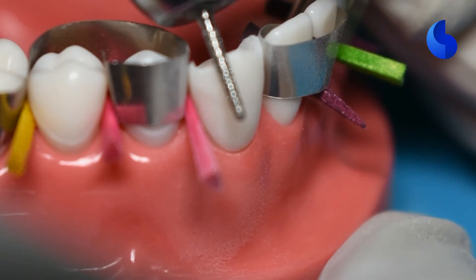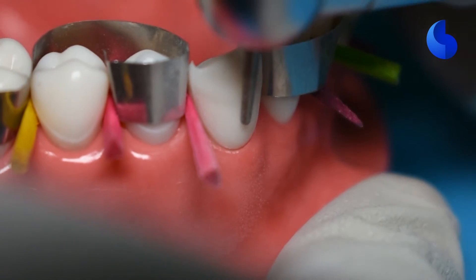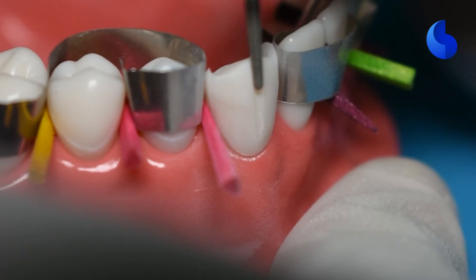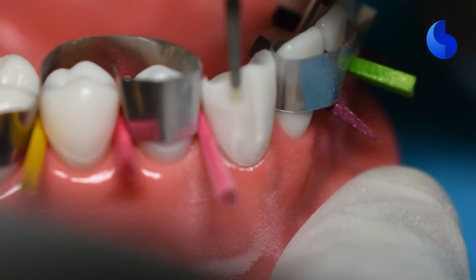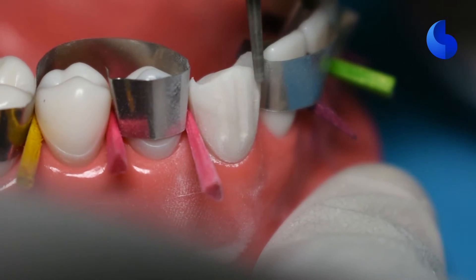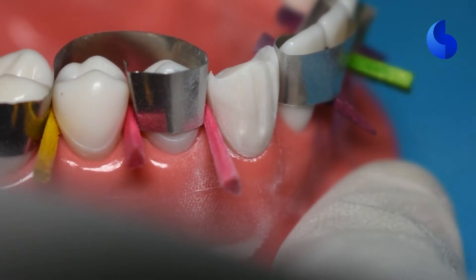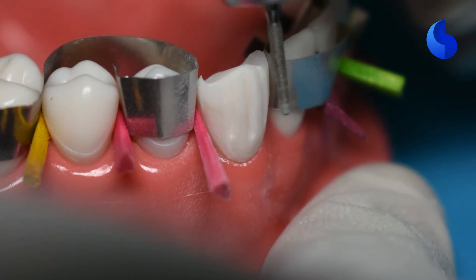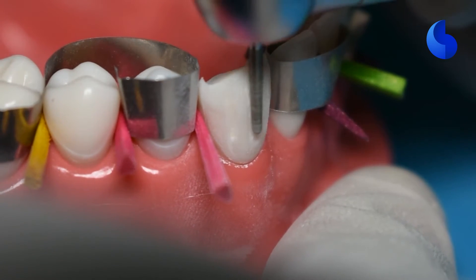Once you're happy with that, our next step is to move on to our facial reduction. For the buccal surface, the clearance we are looking for is one millimeter of porcelain thickness. You can start with placing one depth groove in the middle of the facial wall at a depth of 0.8 millimeters, and then place another depth groove at the mesiofacial and the distofacial transitional line angles. These three depth grooves should give you enough orientation to reduce your facial surface. Once placed, go ahead and use your 856-016 bur to reduce the islands of tooth structure between these depth grooves.